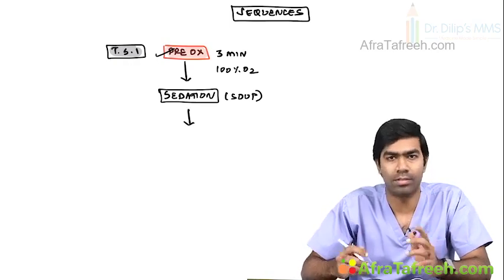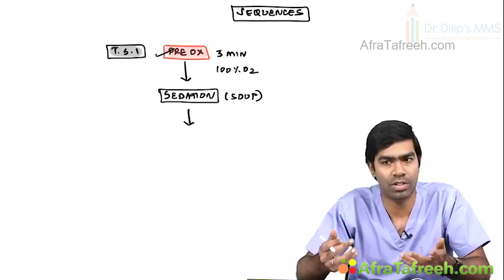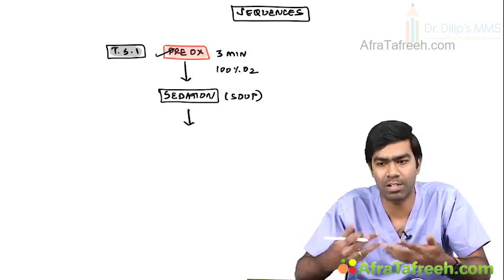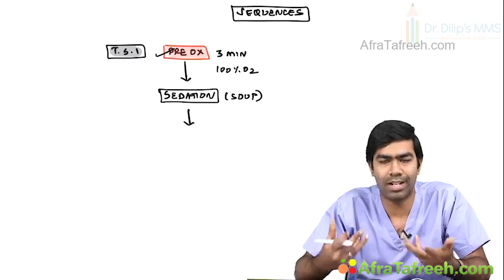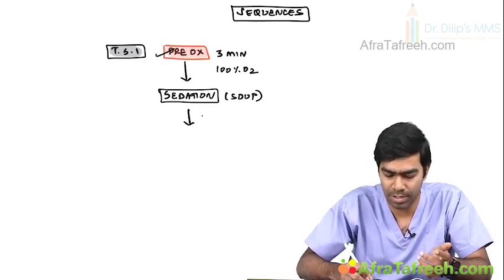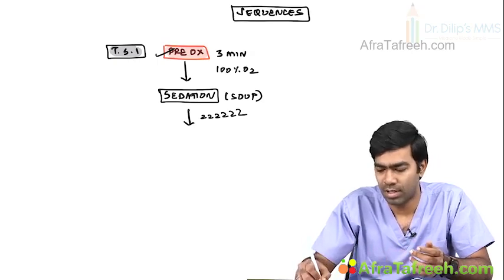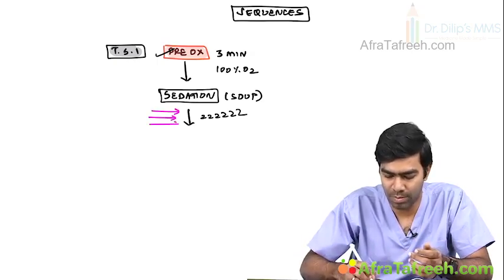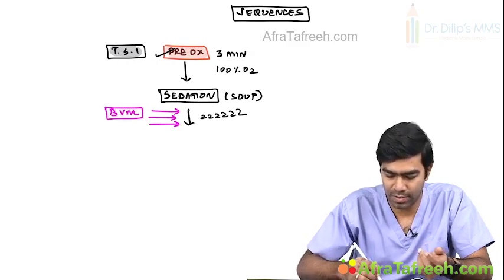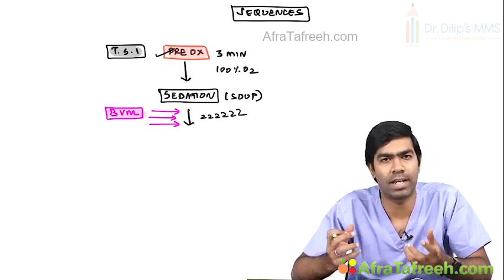So unlike your rapid sequence intubation where you don't add a soup, instead you will add only one particular agent because it's very rapid and fast, here you have a lot of time. So you can take some time. You can give multiple agents and allow the patient to sleep. So now once the patient starts sleeping, the anesthetist will definitely do one very, very important process called bagging. Either the anesthetist or the assistant to the anesthetist will be doing this bagging.